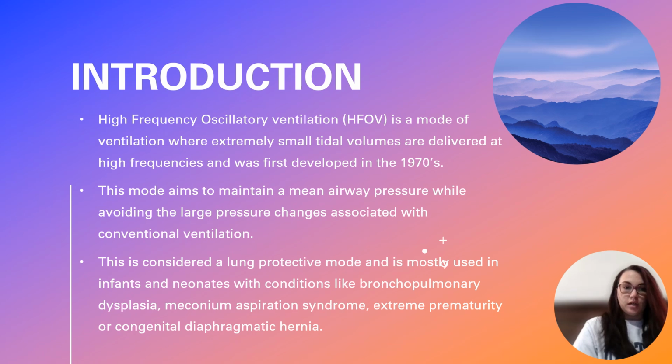This is a mode of ventilation where you take very, very small tidal volumes that are usually less than anatomical dead space, delivered at very high frequencies. It maintains a mean airway pressure while avoiding large pressure changes that are associated with conventional ventilation, and this is generally considered a lung protective mode. You'll see it most often used in infants and neonates with conditions like BPD, meconium aspiration syndrome, extreme prematurity, or diaphragmatic hernias. These are not the only uses for it, though.